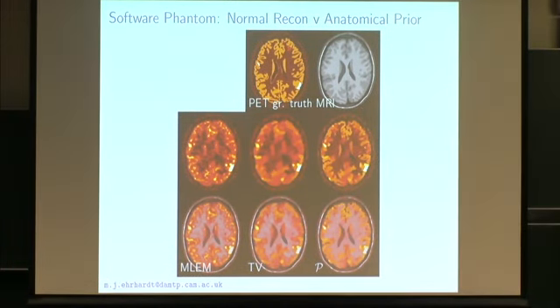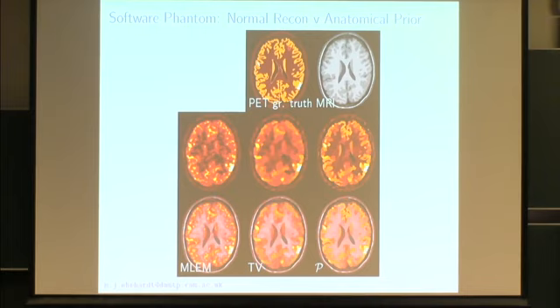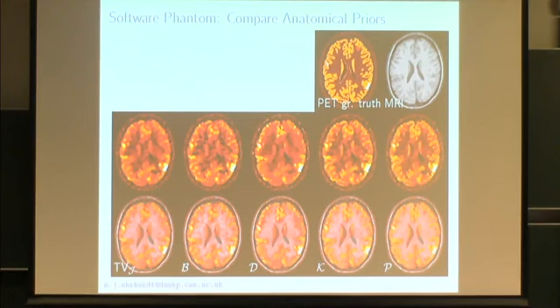And now let's compare this proposed prior to some independent reconstructions. We only reconstruct PET with either MLEM or with total variation, and then we either show it normally or overlaid on the MR, and we can see exactly what we hope for: by using the high resolution MR information, we get better defined features in PET. If we compare the five priors, they now all use the high resolution MR information. And we can see, similar to the error plots, that the two methods that use parallel level sets to couple the gradients give a higher level of detail.